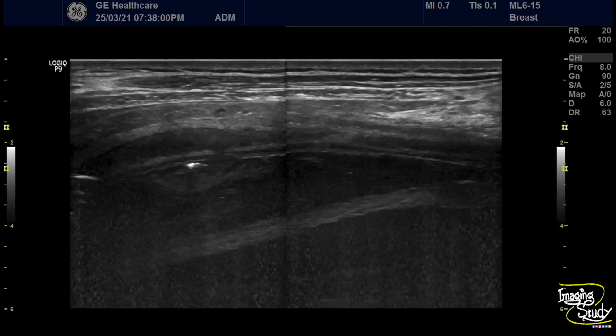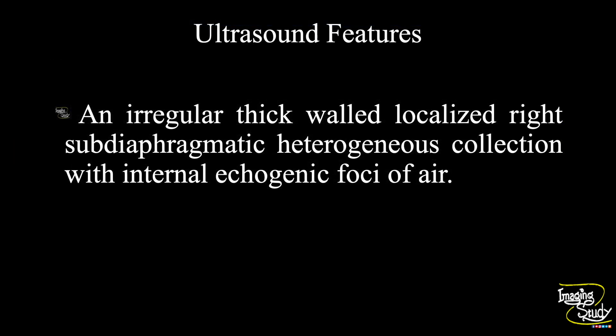Here is the linear transducer view and you can see the heterogeneous area with thick margin and hyperechogenic air droplets. In summary, an irregular thick-walled localized right sub-diaphragmatic heterogeneous collection with internal echogenic foci of air is noted, indicating sub-diaphragmatic abscess.